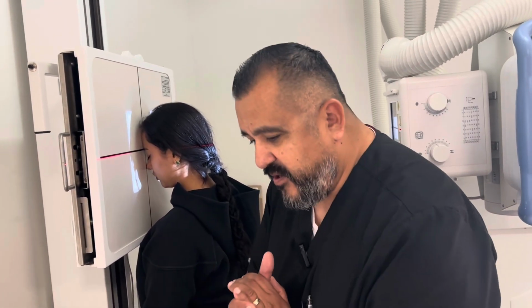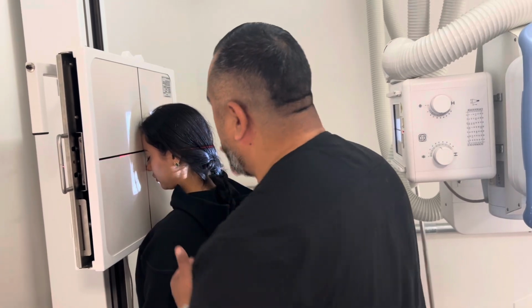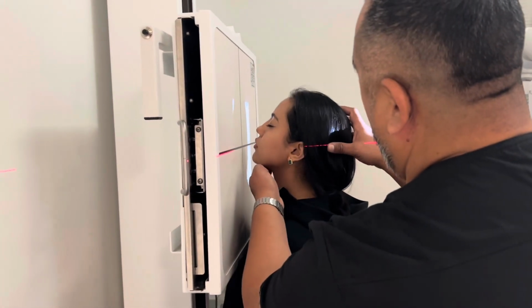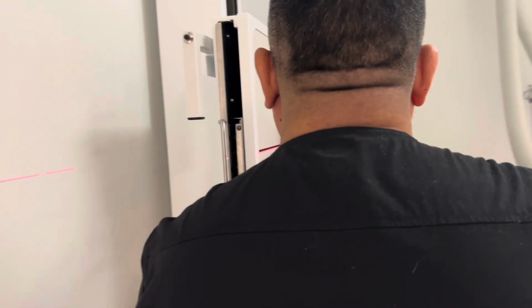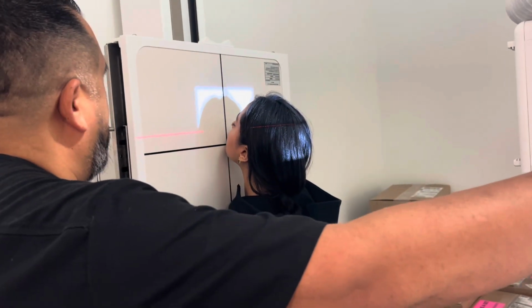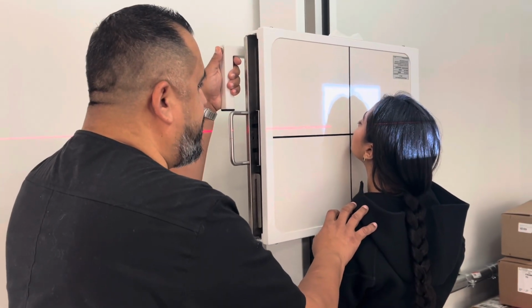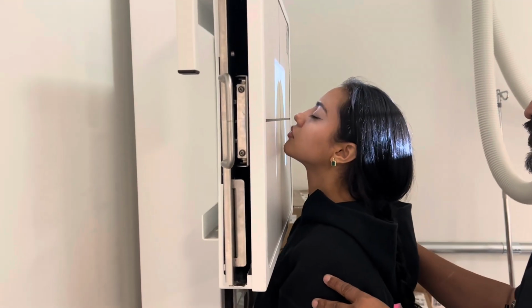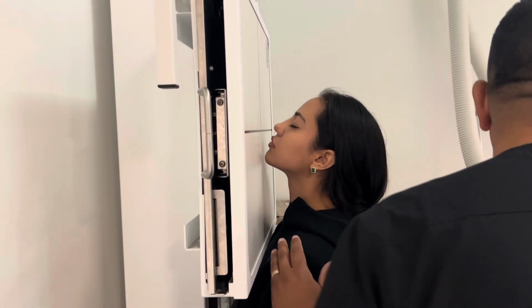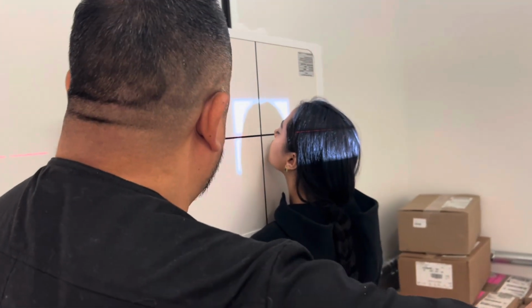So now we're going to go ahead and do the Waters. And remember, you want to keep your chin above water, right? So we're going to tilt your head back. And we're going to place your MML perpendicular. And this time we're going to exit through the acanthion, right at the acanthion. I'm going to bring this up here. Watch your chin. All right, there we go. Bring her over a little bit. Make sure the mid-sagittal plane is coming down the middle. There we go, right there. And that's your Waters.